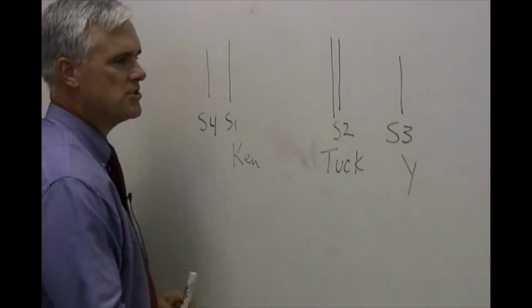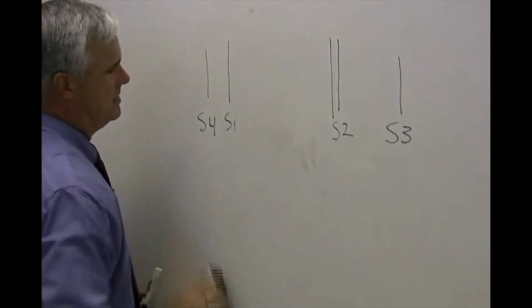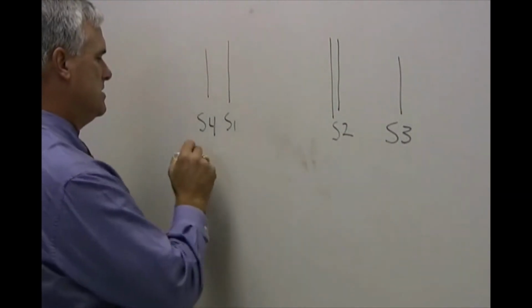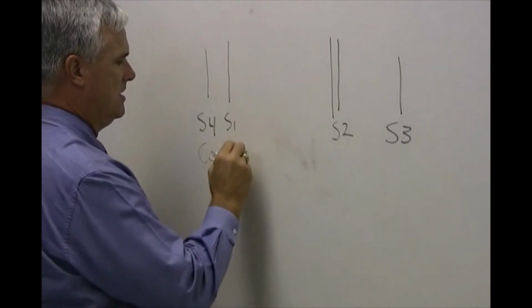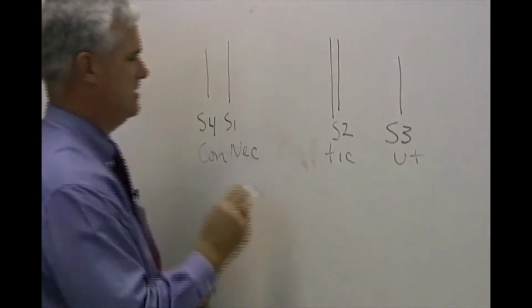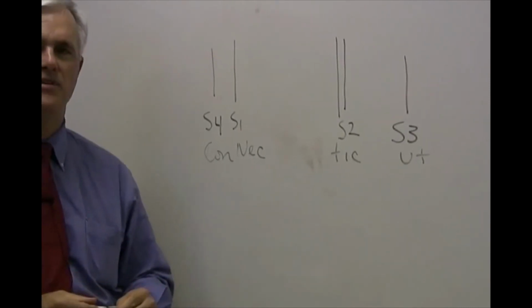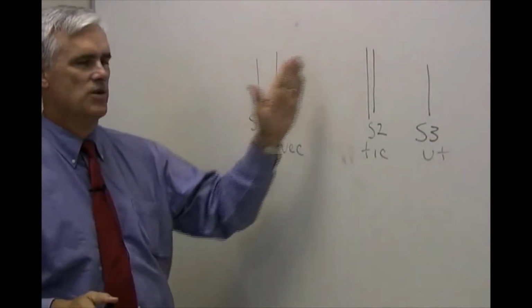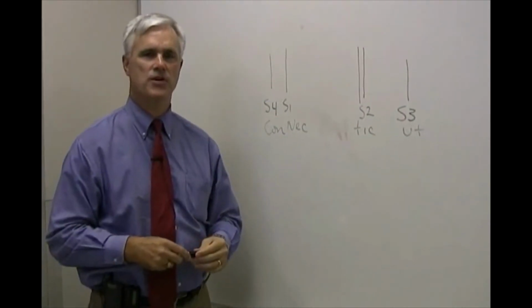Now sometimes the patient will have both an S3 and an S4, and the mnemonic for that is Connecticut. So just use the states and you should be able to time these things out. Start out with S1 and S2, listen for the splitting, then listen for the gallops before you start looking at the murmurs.